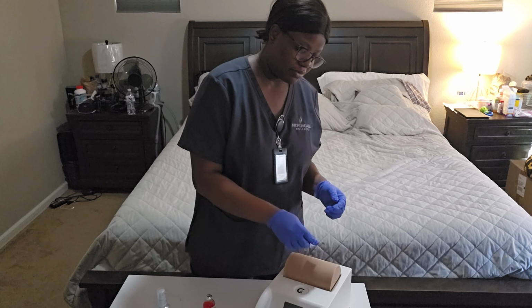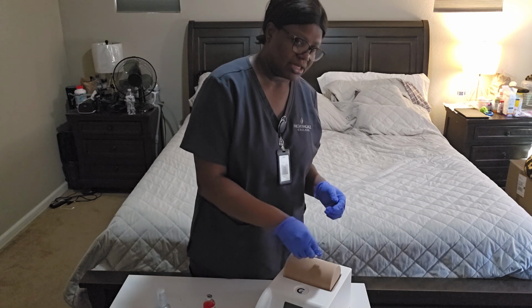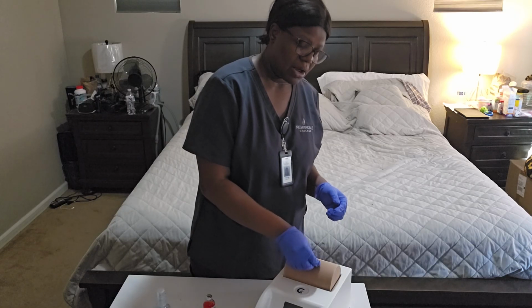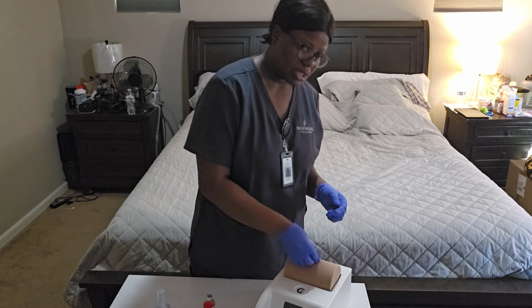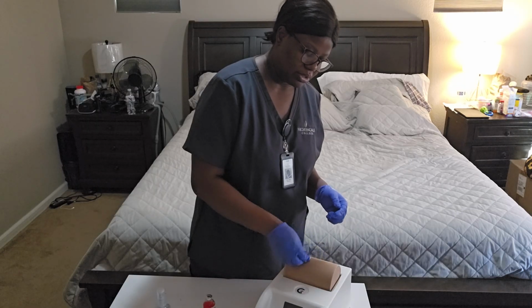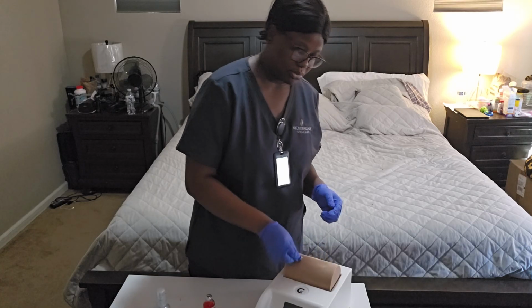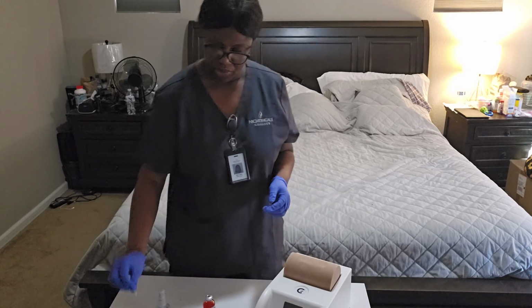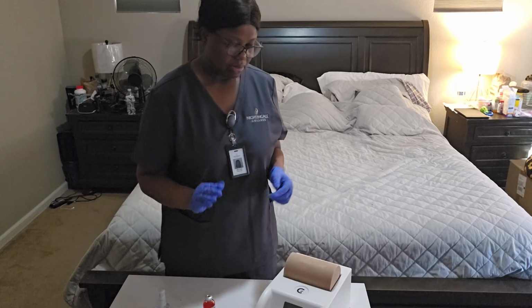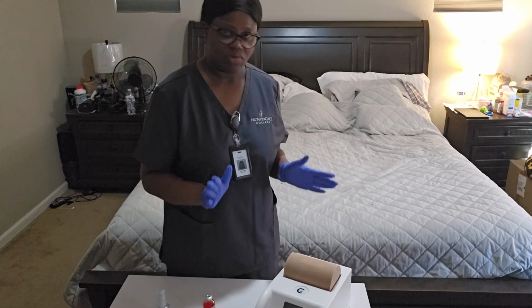I'm going to clean from the center, and then the side, and rotate around. Okay, 5 cm, 2 inches. Rotate around. Make sure everything is cleaned properly. I'm going to dispose of this. I'm not going to touch the inside. I'm going to let it dry on its own.